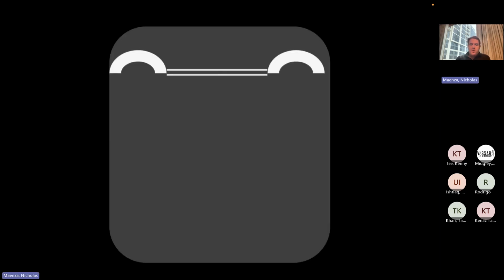And then my wonderful animation. So this is your patient. You have the rib, the parietal pleura, and the visceral pleura. So lung point is when half of that pleura is gone, and you're just looking at that one area of lung. So this is the pneumothorax, and this is the normal aerated lung, and you're finding that pleura kind of slide in and out.